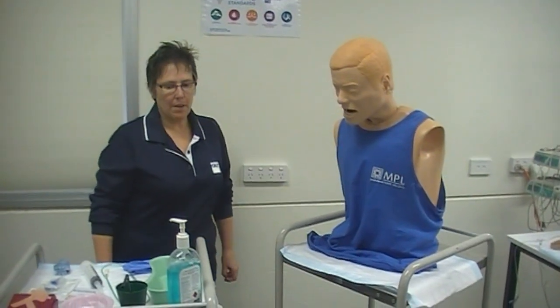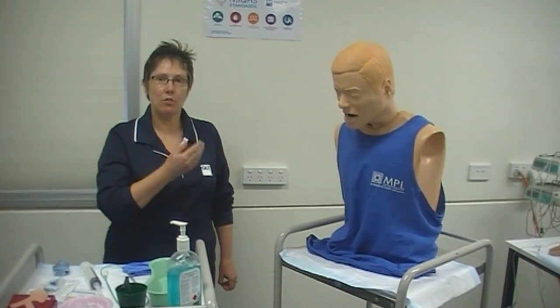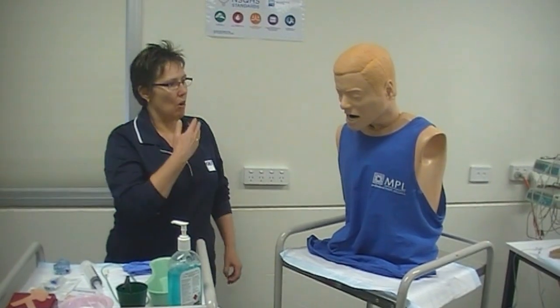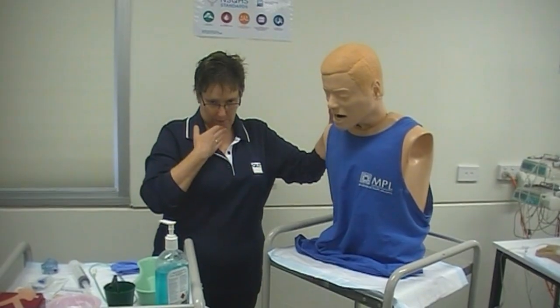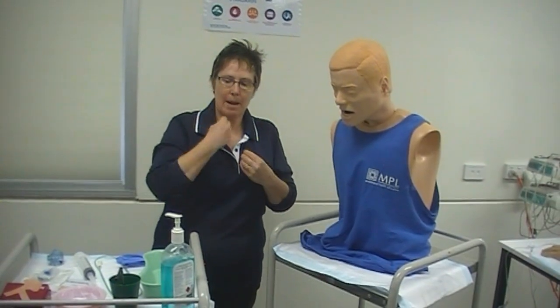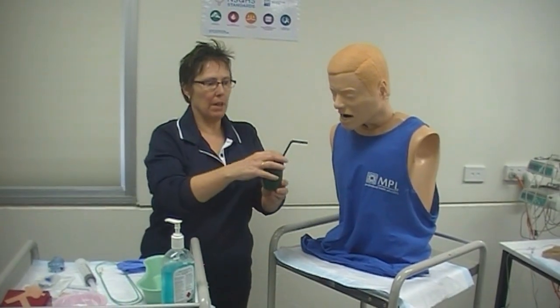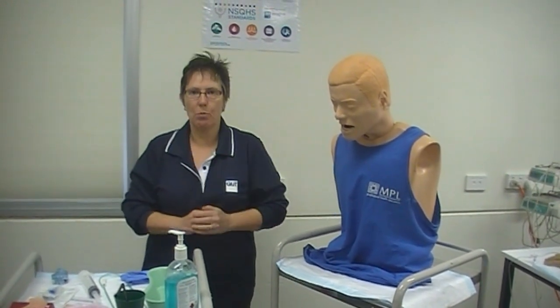I'm ready to put in my nasogastric tube. I've already explained to my patient what I'm going to do, I've got informed consent, and I should have a medical order for this procedure. I've positioned my patient sitting upright. Not all patients can be sitting up, not all can cooperate with this position, and not all are able to swallow water if they're nil by mouth — so you need to individualize your approach. But this is the ideal.